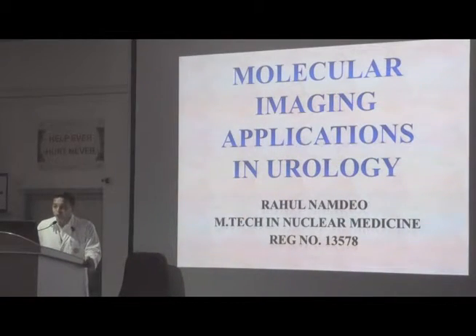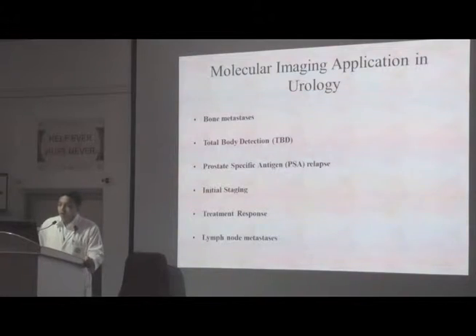My topic for today is molecular imaging application in urology. There are certain applications of molecular imaging in urology, like bone metastasis, total body detection, prostate-specific antigen relapse, initial staging, treatment response, and lymph node metastasis.